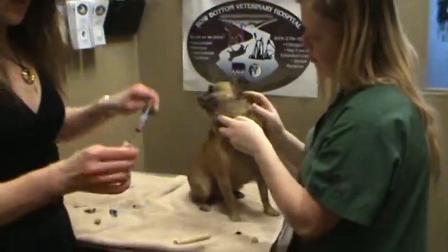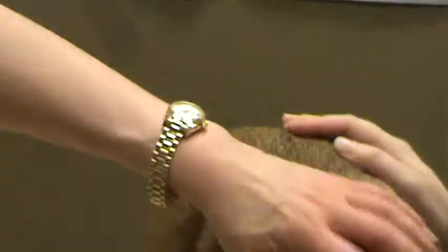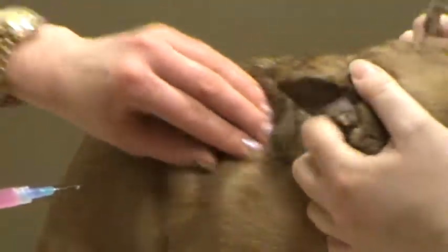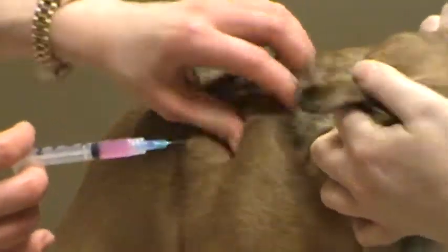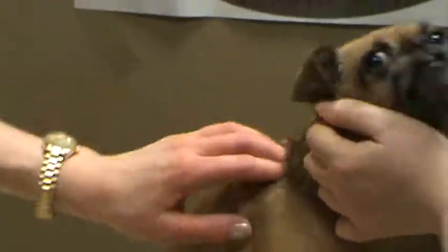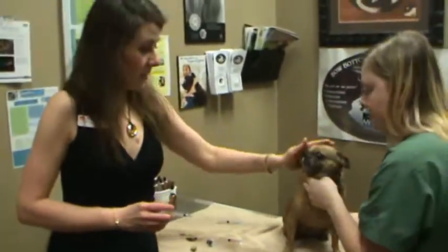For this one I like to give an injection in the shoulder area. So again, you take off the cap and make sure there are no air bubbles. Get somebody to kind of massage the area, then elevate the skin into a skin tent. I like to desensitize the area by touching and massaging, making her feel really good. She might not like this — sometimes they will jump. So I just give her a little injection like that. Really short, right in there. Again, you don't want to depress the syringe until it's right in the skin of the animal.